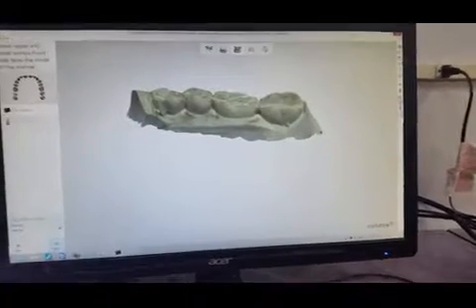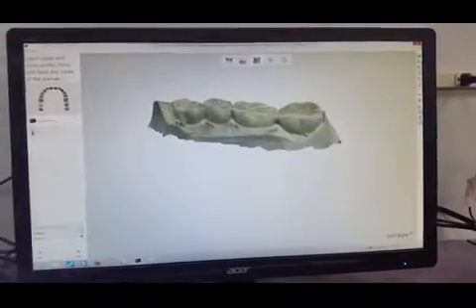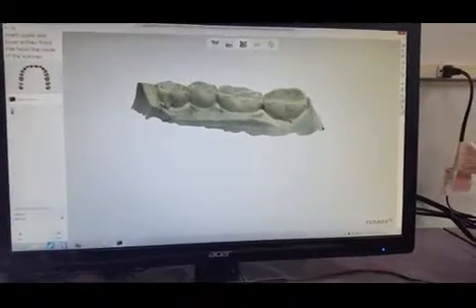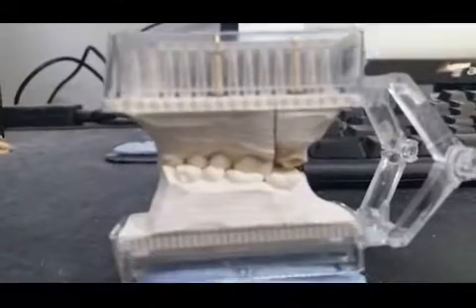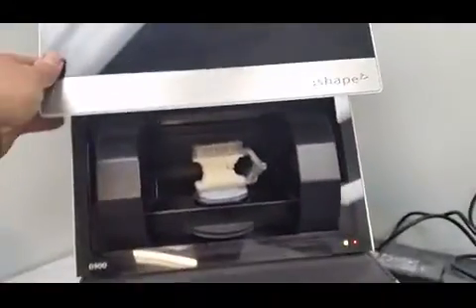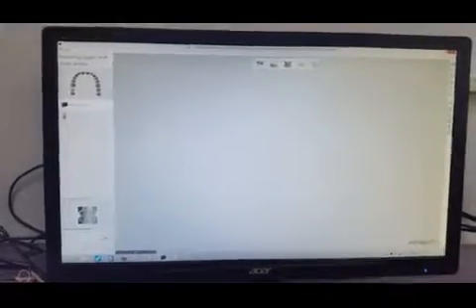Now we tell it to proceed. Now it's asking me to do both upper and lower to pick up the bite. And here's the case. We put the upper and lower bite, and we're going to go ahead and put it in the scanner. Close the door, and it's going to go through the motion.